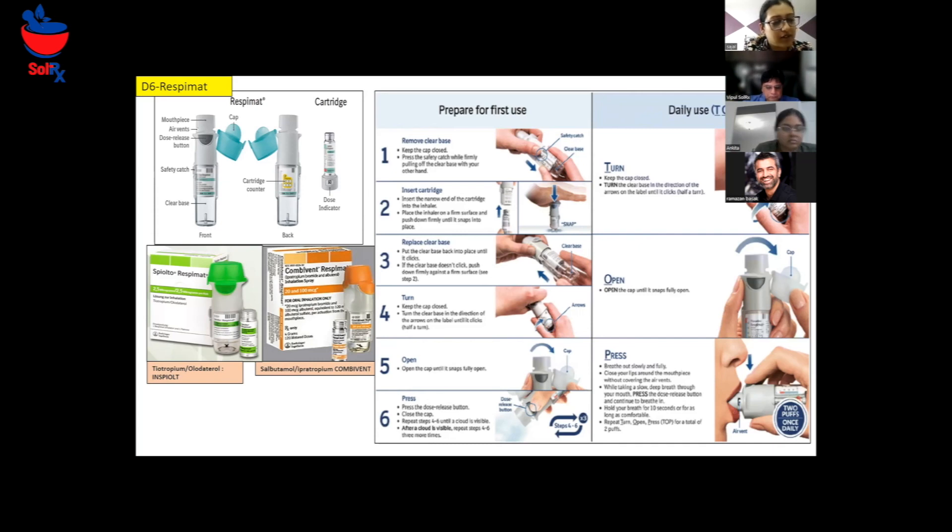Flip the cap open until it's fully open. Then breathe out slowly and fully. Put the mouthpiece between your lips and close the lips around the mouthpiece without covering the air vents. Point the inhaler towards the back of the throat. While you take a slow and deep breath, press the dose release button and continue to breathe in. Hold your breath for 10 seconds or as long as you can.